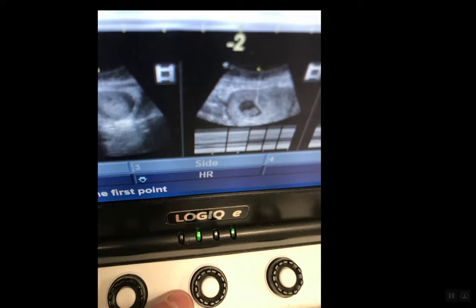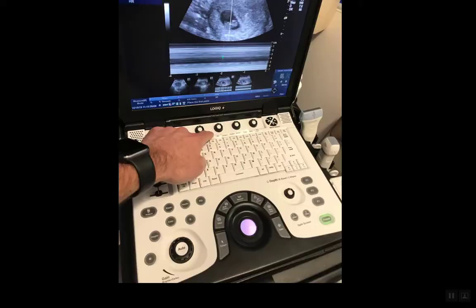To zoom up, it's the third knob in the middle of the screen, which corresponds to the heart rate button. You just press it once — you don't turn it right, you don't turn it left, you don't turn it clockwise or counterclockwise. You just press the button once.